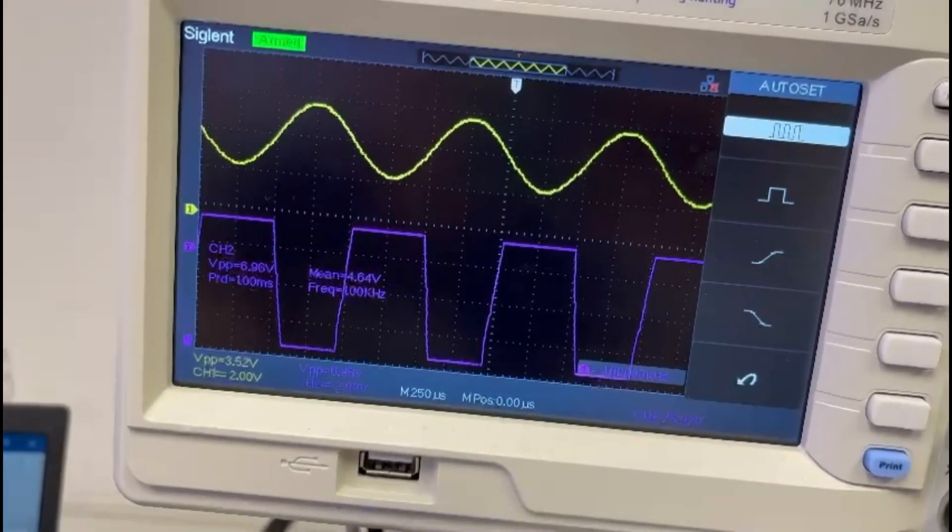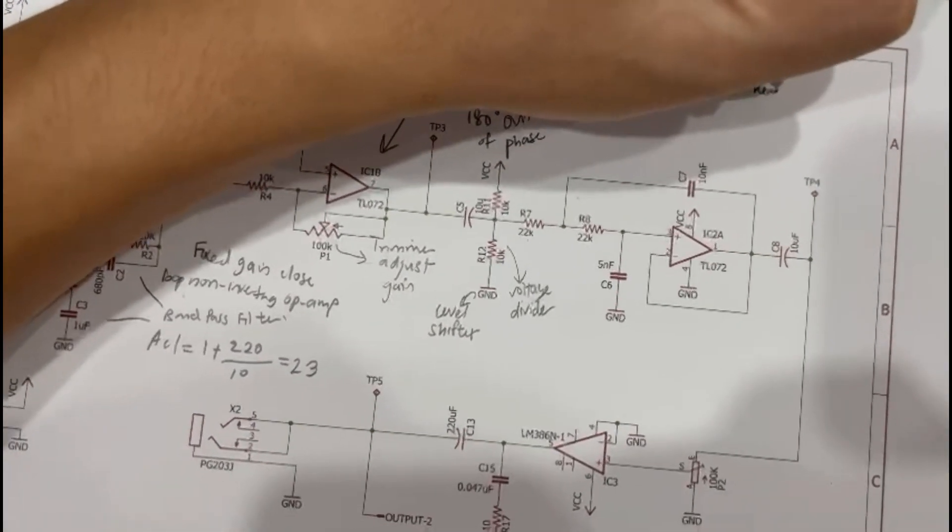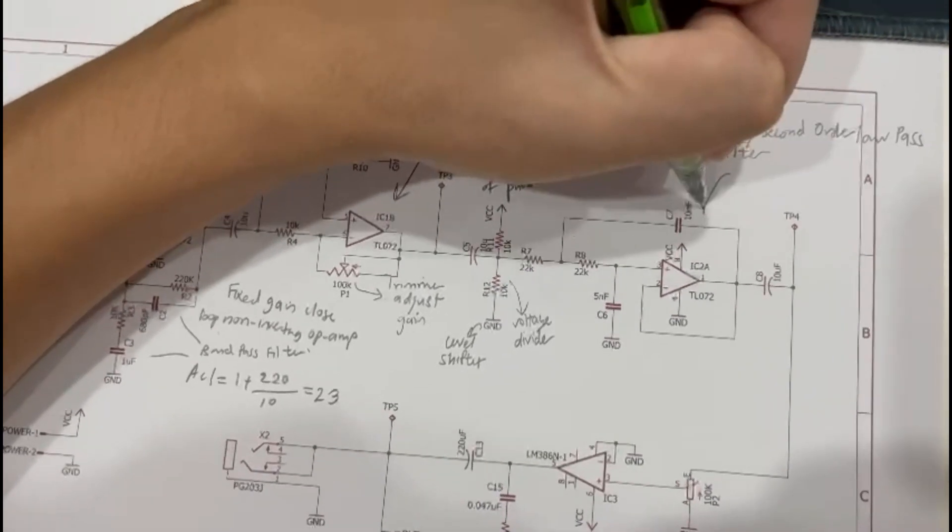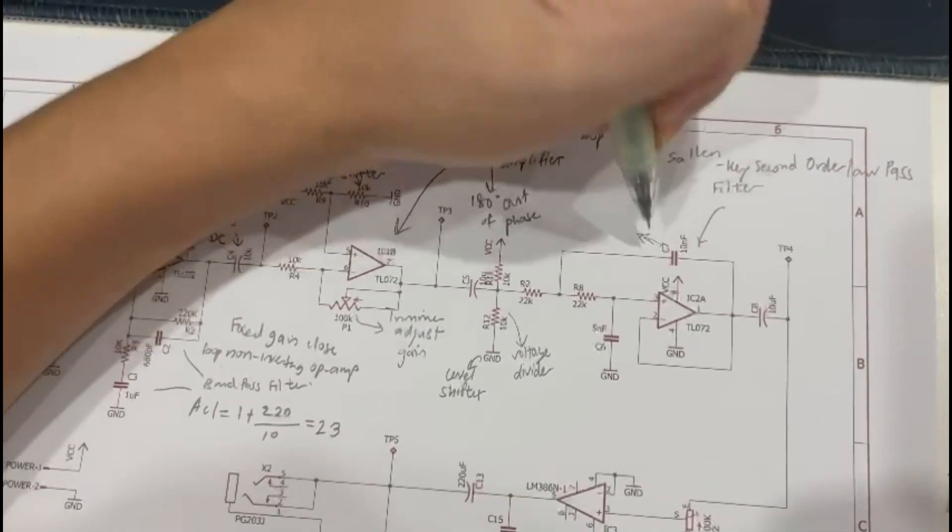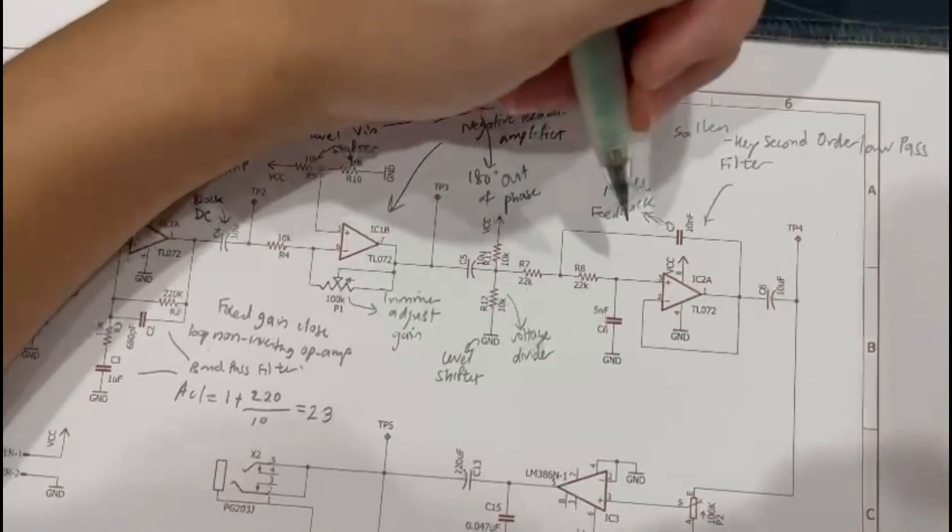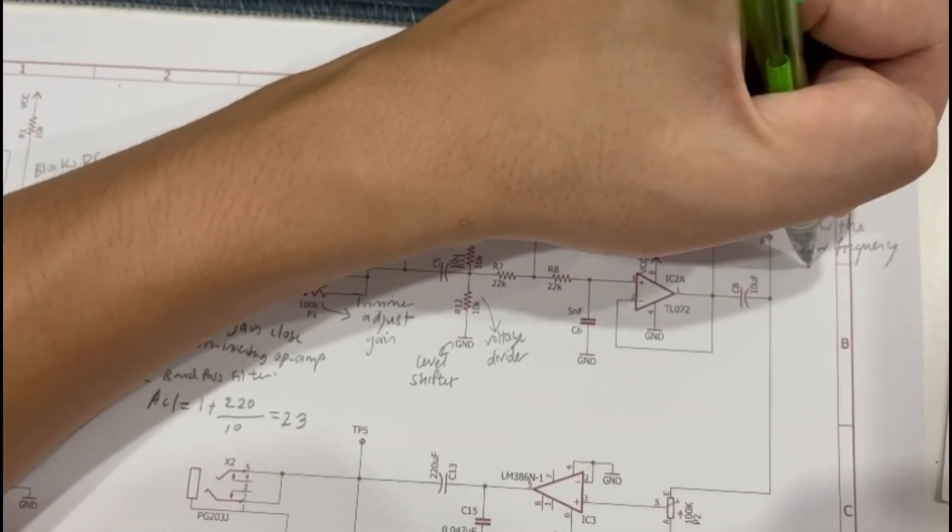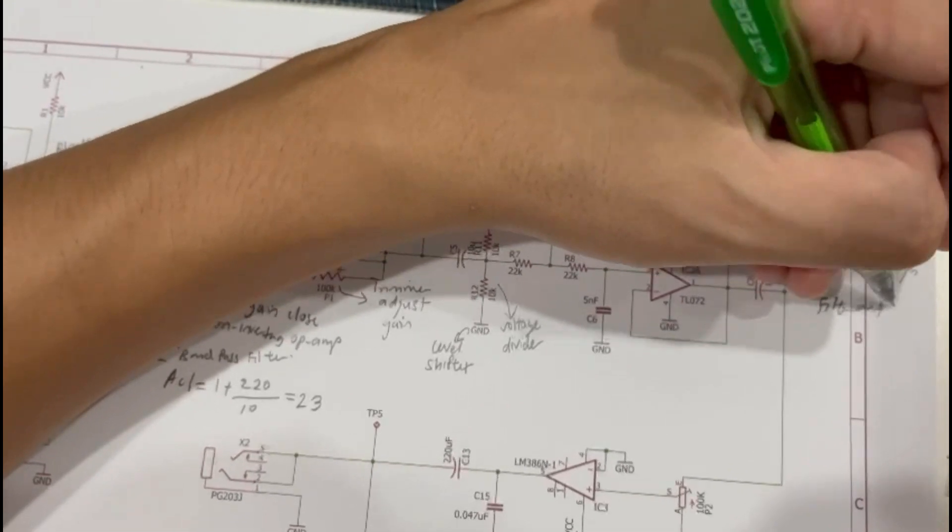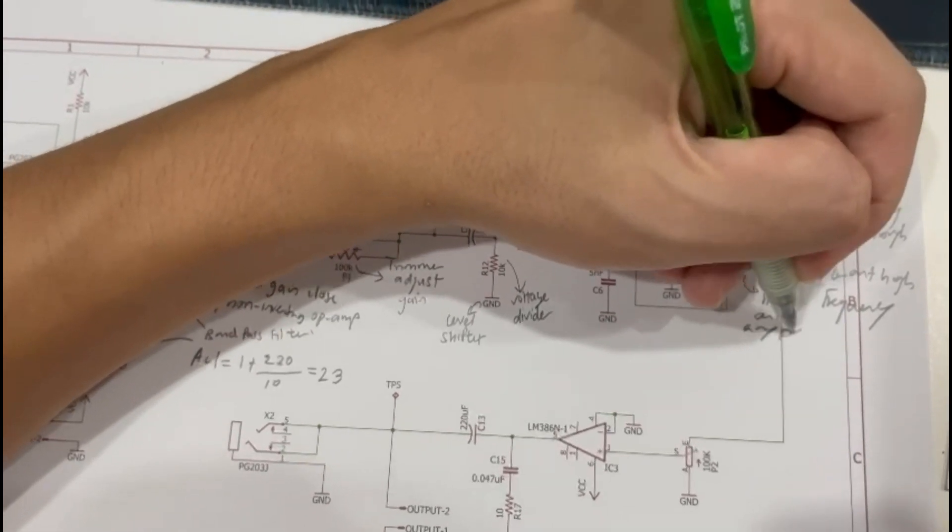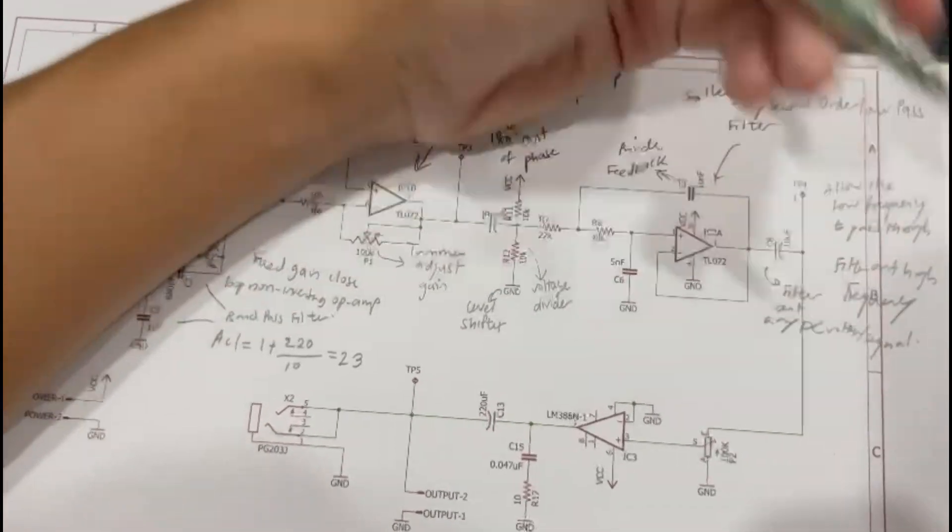In stage 3, capacitor C5 will block out DC and allow AC to pass through. A voltage divider consists of R11 and R12 of 10kohm acts as a single supply mode for the second IC TL072. For IC2A, a second TL072 is being used. It is patched as a Sallen-Key second order low pass filter. It is made out of two low pass RC networks. Capacitor C7 will provide feedback of shaping the response near the edge of the pass band and it allows low frequency to pass through while filtering out the high frequency. Output voltage from IC2A will then pass through capacitor C8 at 10uF to filter out any DC. As the lowest frequency can pass through with 0Hz, then the bandwidth will be equal to the cut-off frequency given by this equation.